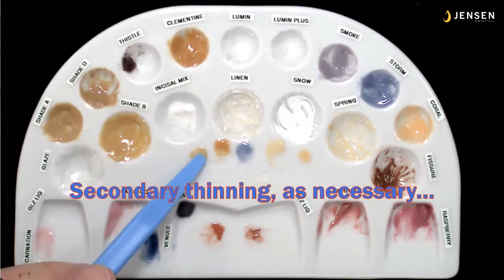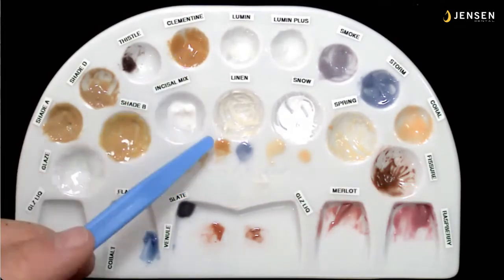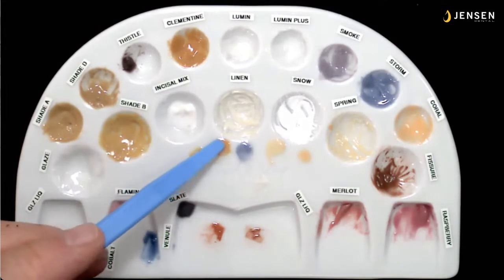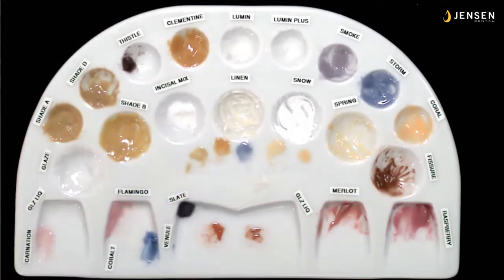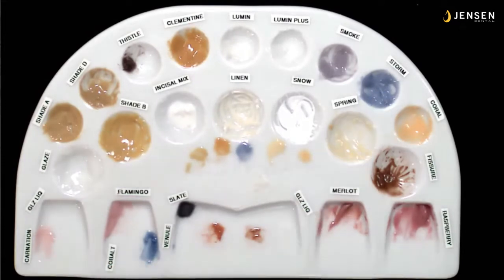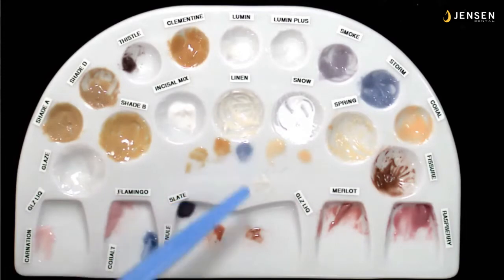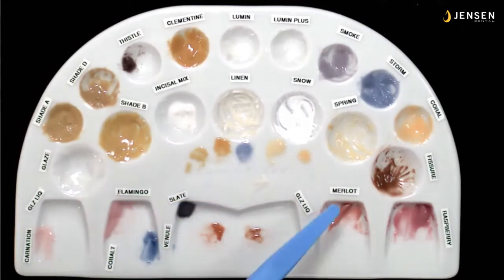So, secondary thinning as necessary. You see there in the flat spot, it's thicker than I want in the wells. The wells are a good base to start from, but if I want tints or I want very, very translucent colors, I'm going to put just a little bit there. That's about the size of a hole from a notebook paper hole punch.